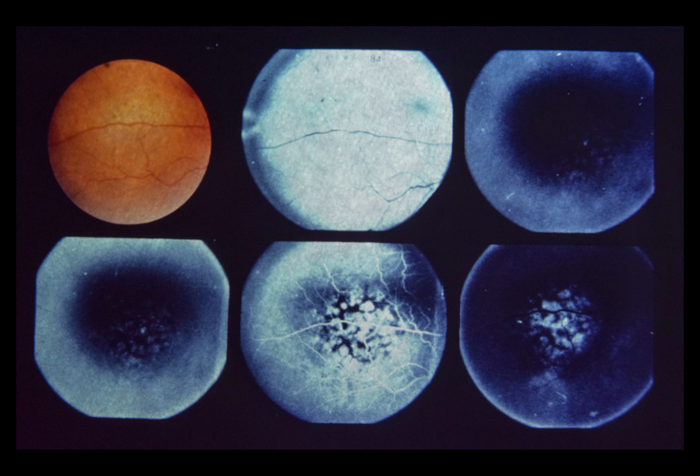This patient was seen through the courtesy of the oncology unit of the retina service at Wills Eye Hospital. Diagnostic studies performed there included a negative P32 test and a B-scan ultrasonogram, which showed an oval-shaped echo with a smooth anterior border, numerous internal reflections, and no choroidal excavation. Both tests were consistent with the diagnosis of choroidal hemangioma rather than melanoma.